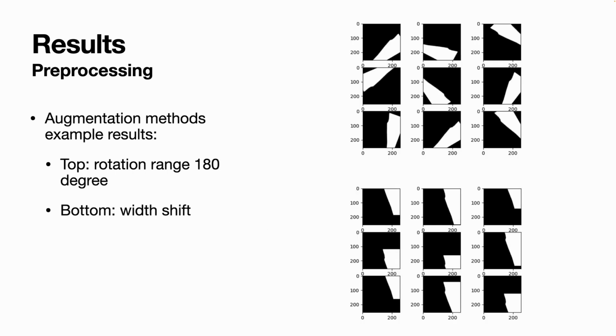After the fine-tuning mask step is done, augmentation methods are selected and done on the fly in the training phase when starting the software. The slide here is an example where I saved the augmented images for debugging purposes only. This debugging step is also important because it ensures the augmented images are meaningful and could be recognizable even by the human eye. Otherwise, the model will learn irrelevant information and could cause greater errors in the output.